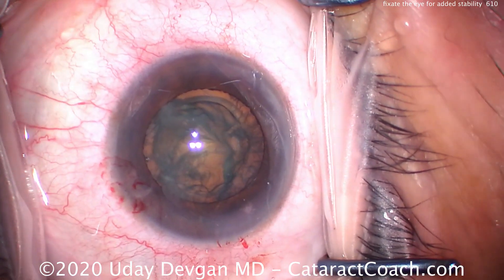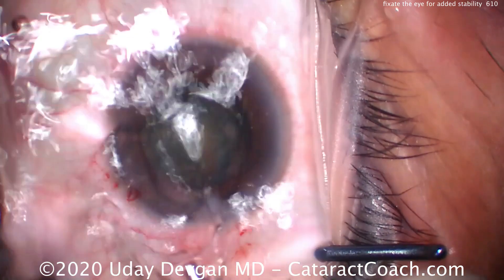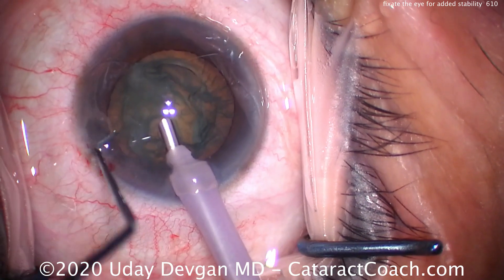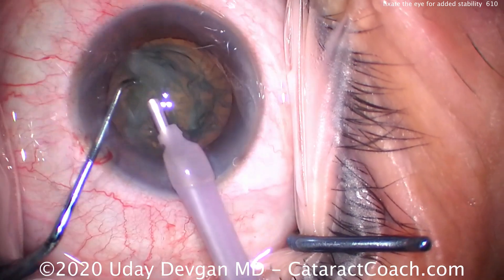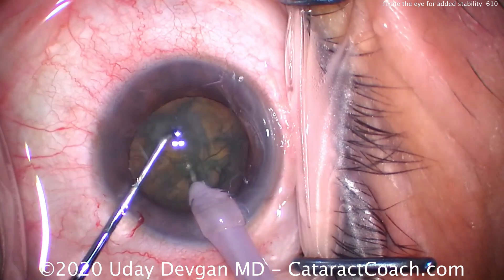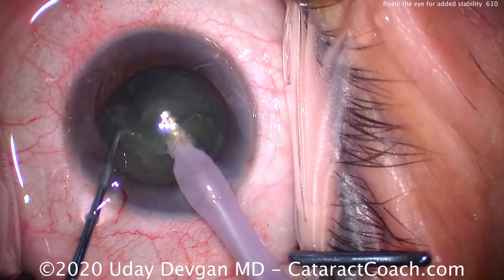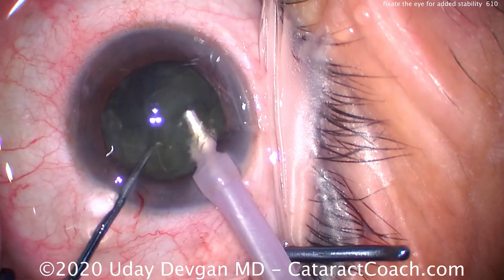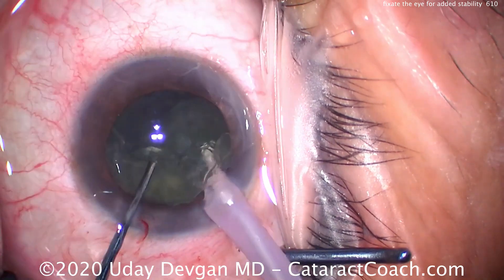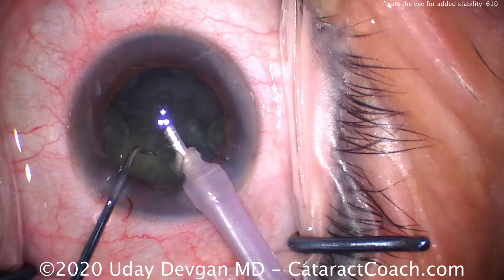Now once we have two instruments in the eye — phacoprobe in the right and chopper in the left — I can just do my regular cataract surgery. These two instruments provide two-point fixation so the globe is not going to move anymore. I'll use the chopper and the phacoprobe to split the nucleus and we can just operate as we normally would. The patient's extraocular muscles are unable to overcome the fixation that I have with two instruments inside the eye.